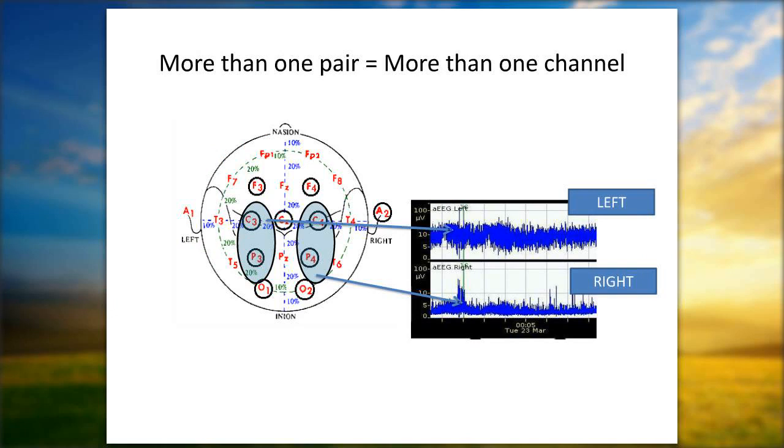So by adding an additional electrode, for example here at C3P3 and C4P4, just by adding those extra central electrodes... I think we started adding these central electrodes mostly because these were already part of the traditional montage for neonatal EEG, and so we already had some voltage history at these locations that we could have used, and their proximity to especially HIE injury, and knowing that parasagittal injury for HIE really happens right along this central sulcus and extending back towards the parietal lobe.